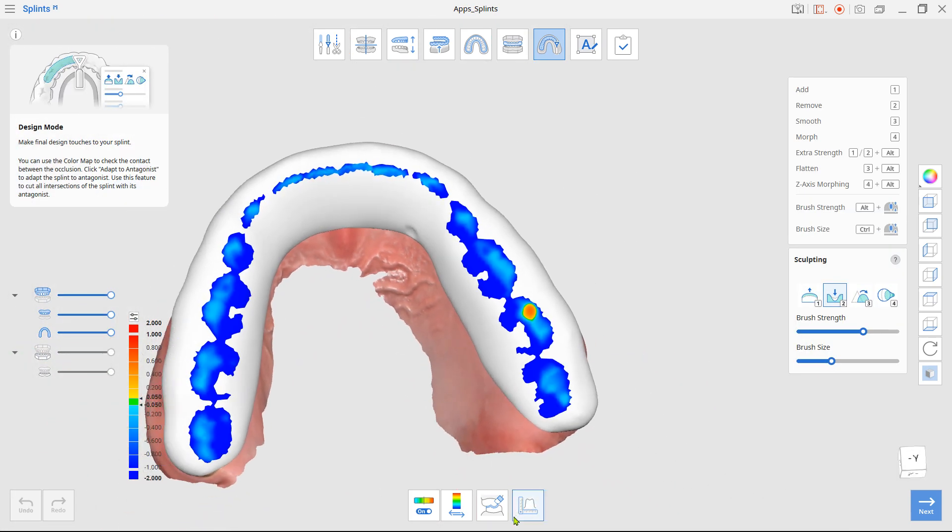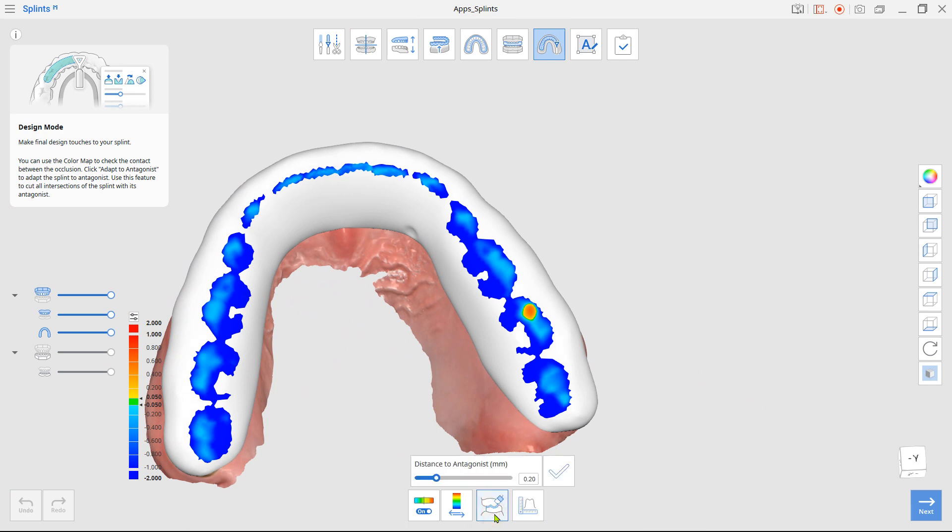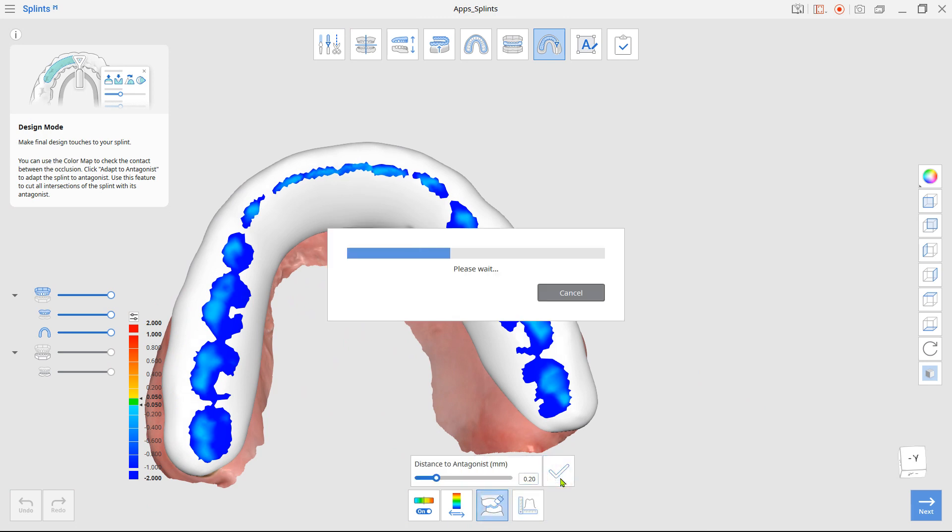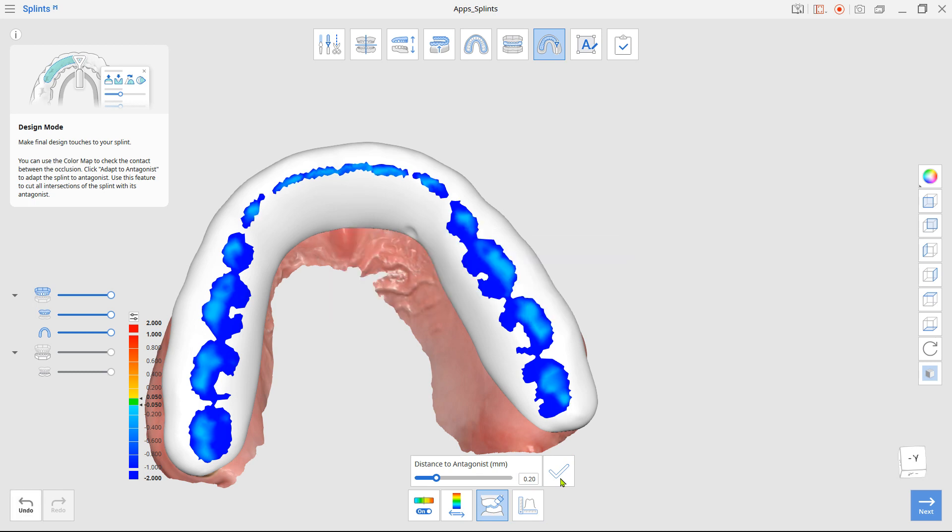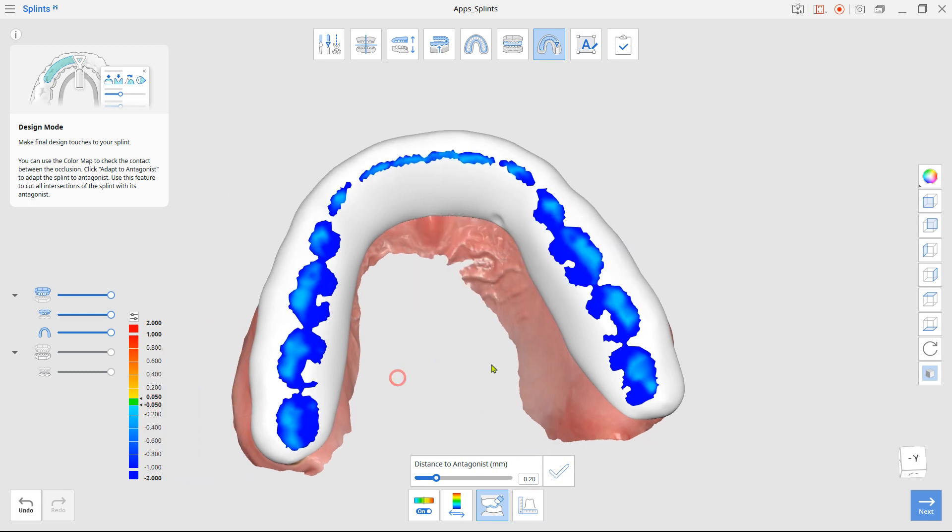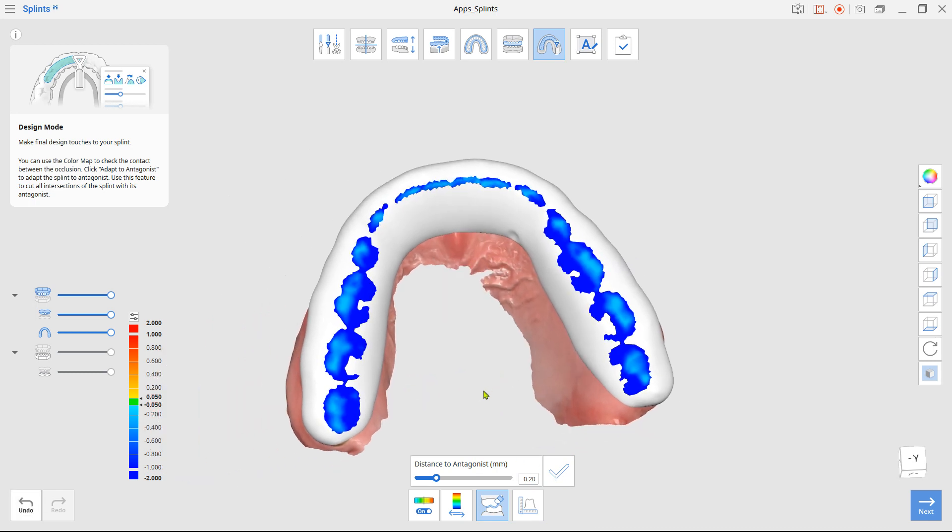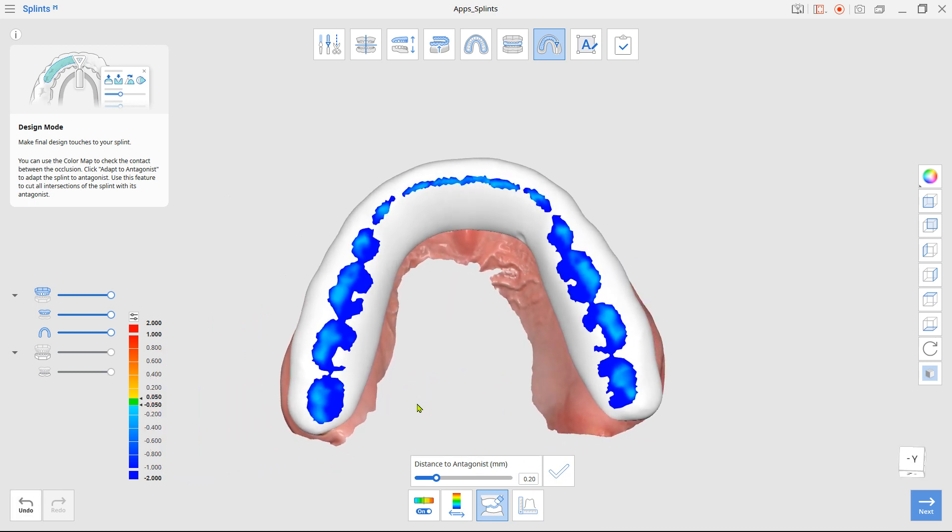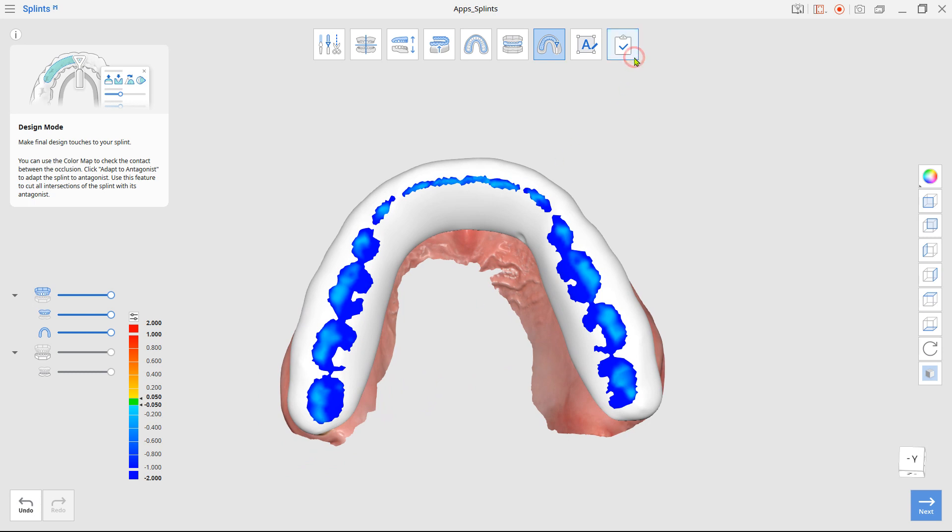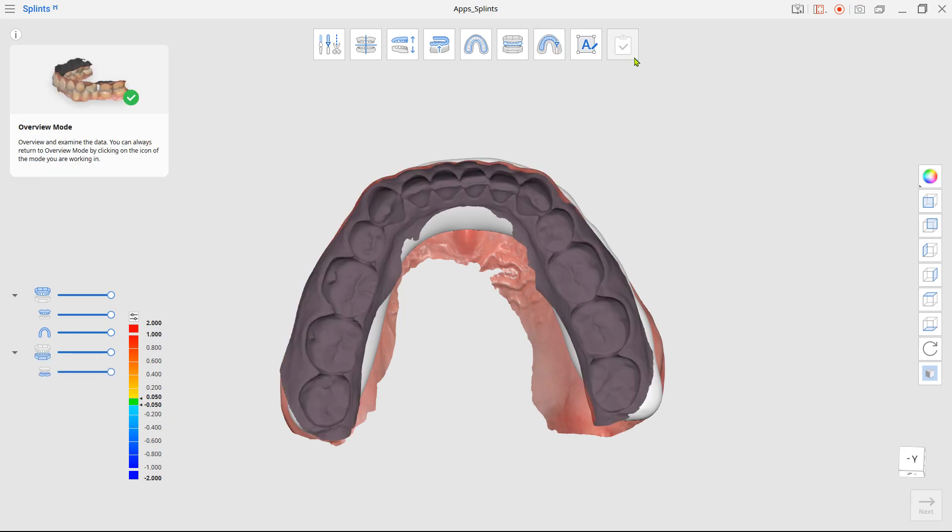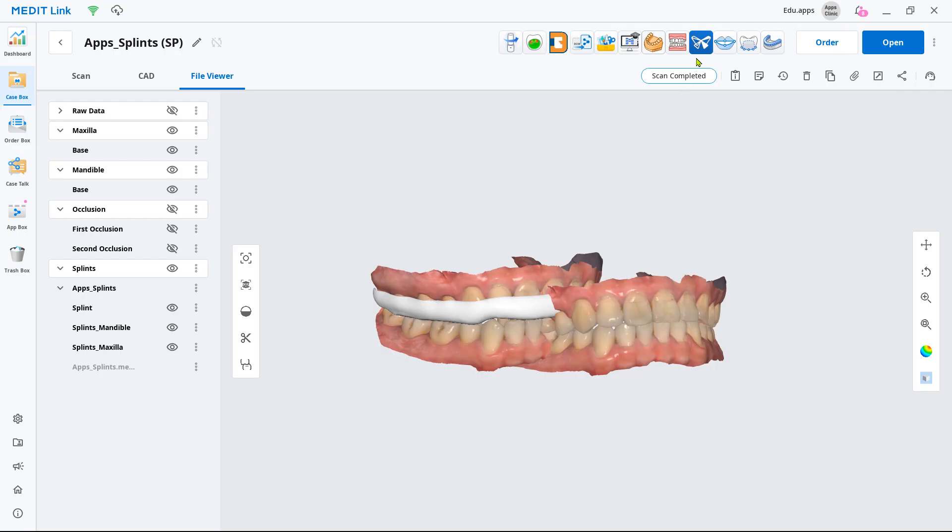And click the adapt to antagonist from the bottom. Set the value that you want to remove and click apply. Review the created splint and click complete to save it.